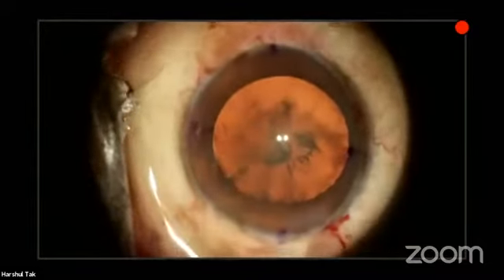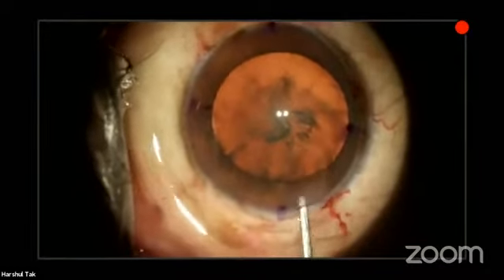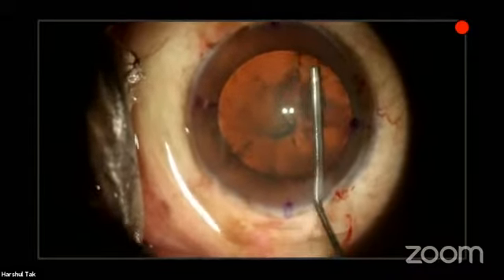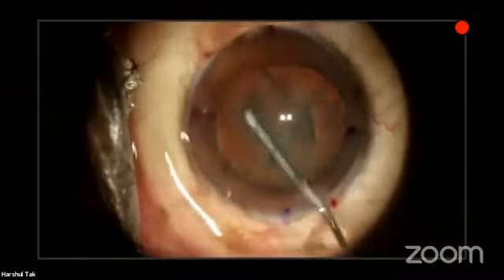Okay, so now we have a capsulorhexis which is not more than 5 millimeter here. Go ahead and take off the viscoelastic from the anterior chamber before I do hydrodissection. And here the wave traverses down.